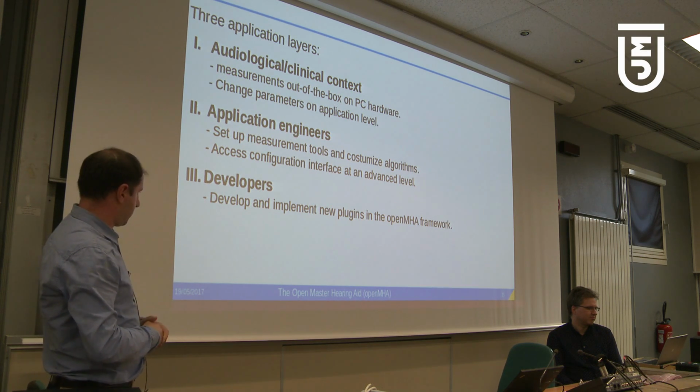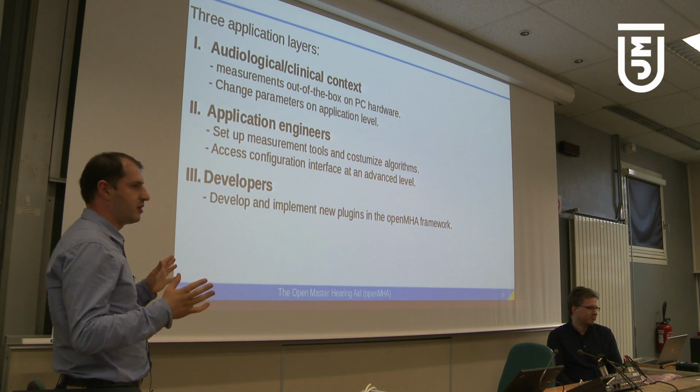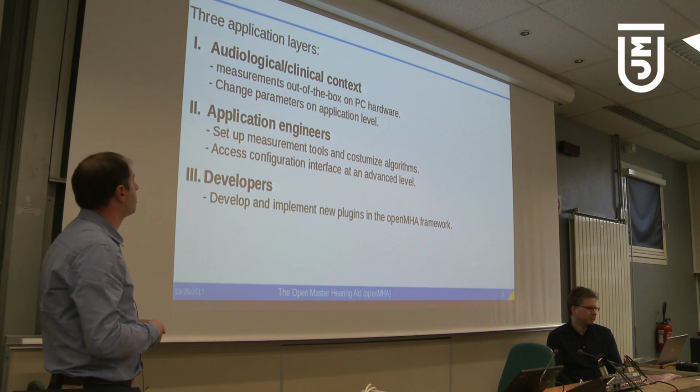The other layer is so-called application engineers. I mentioned the command line interface, so one can write, for example, input files which are text-based.